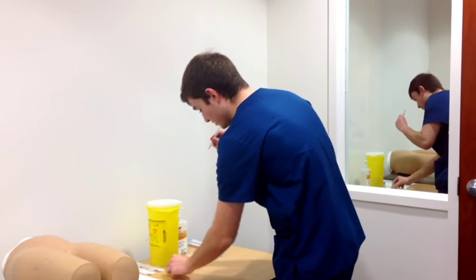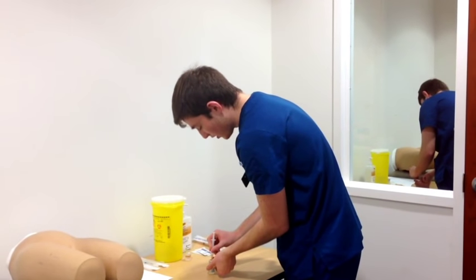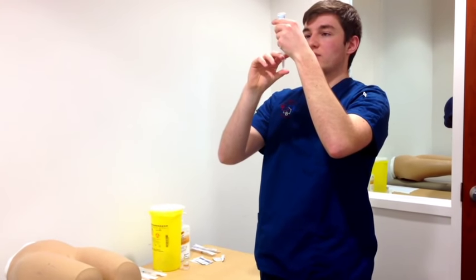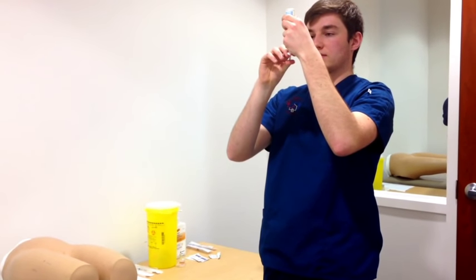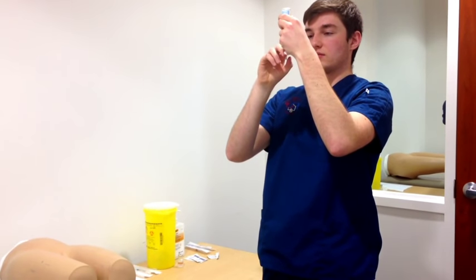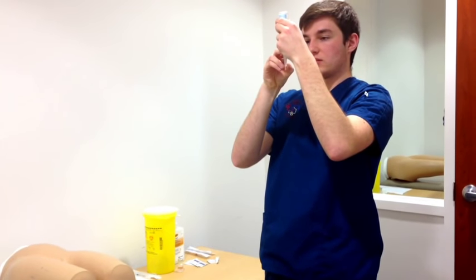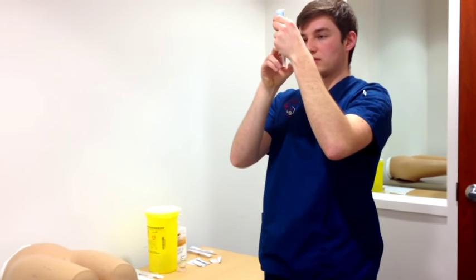Here, I will then insert the needle into the heparin vial. With my non-dominant hand, I raise the vial and keep my finger on the barrel itself. I will make sure the needle is below the liquid and inject the amount of air that would be the appropriate dose. Based on negative pressure, the medication should release back out to me. Remember, keep the needle straight, below the liquid, and draw to 1 milliliter.